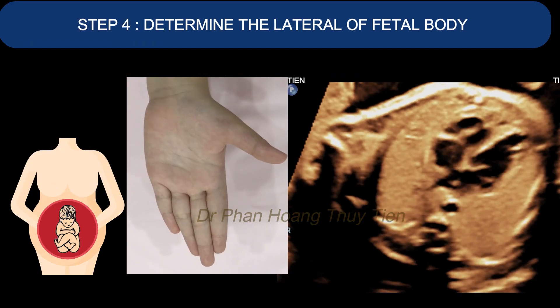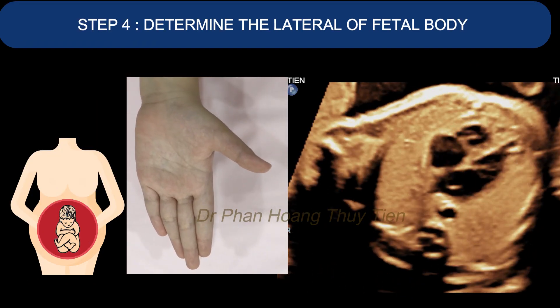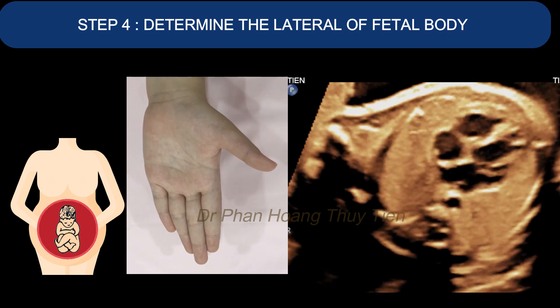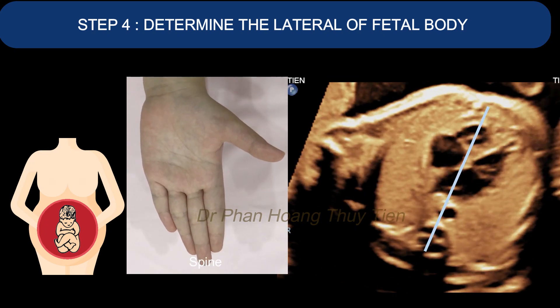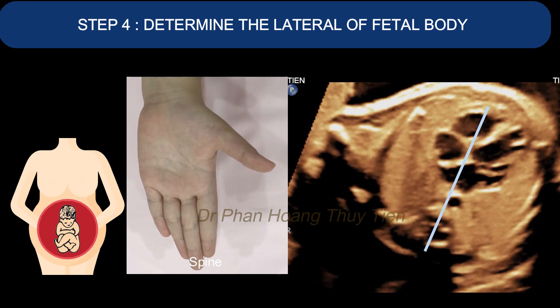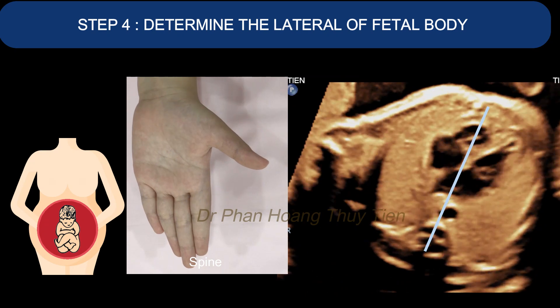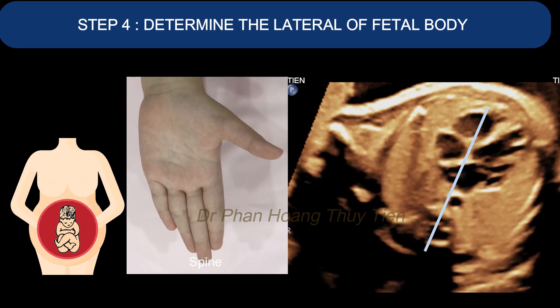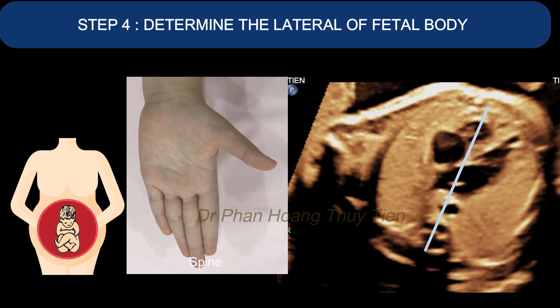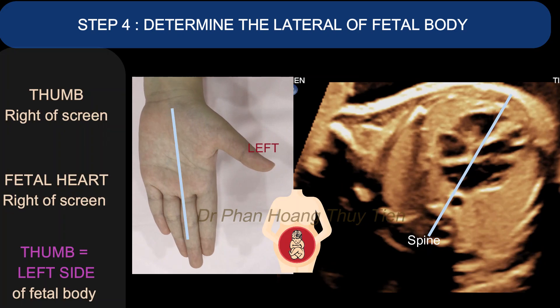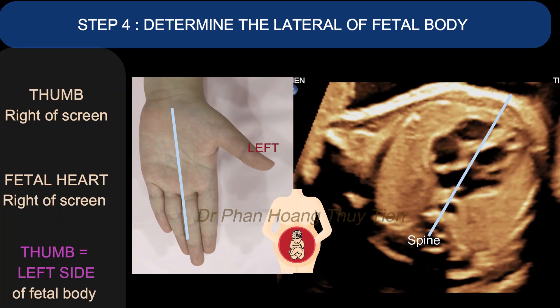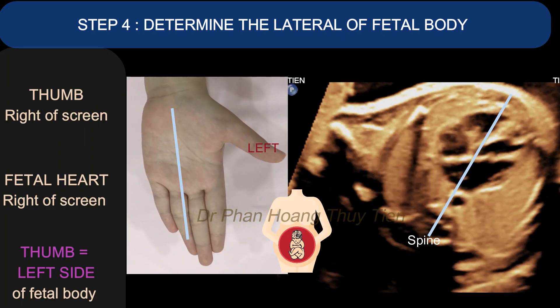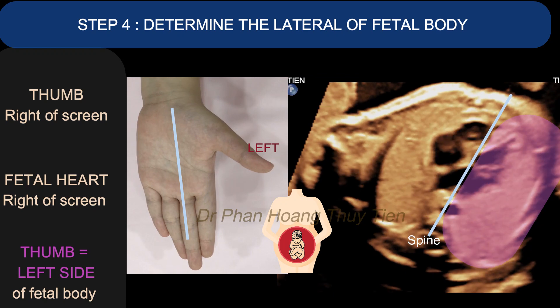Step 4: Determine the laterality of the fetal body. With the transverse view, you will need to create a straight line from the spine that divides the fetal body into half. Then you apply the technique from the previous step.